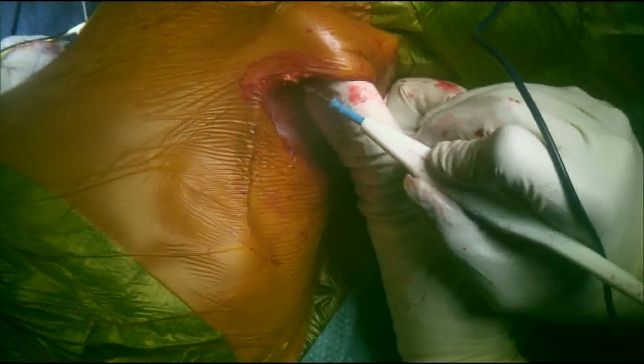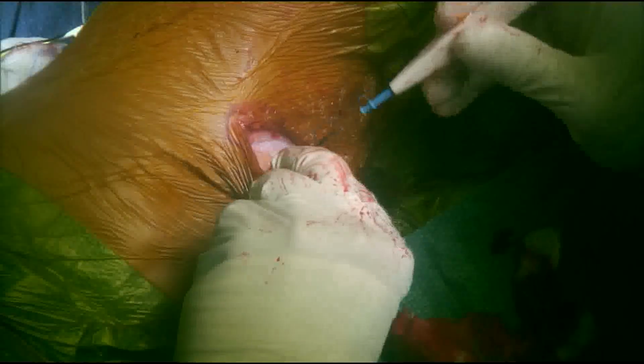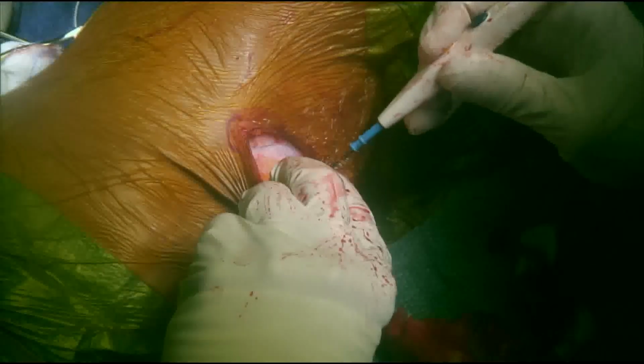This would increase the risk of peritonitis and other complications like fistula and infection. When fashioning the abdominal pocket, it should be done from superior to inferior, and you can use a blunt dissection or your fingers in order to make enough room for the baclofen pump.